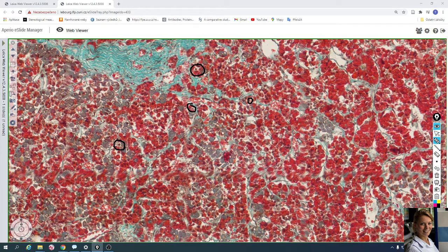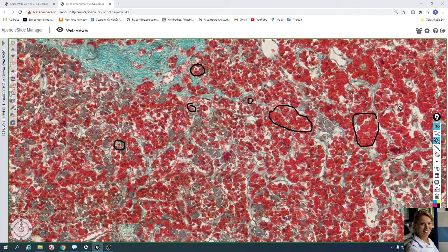Acidophilic cells in the modified trichrome appear reddish. Here is a group of acidophilic cells, and here are more acidophilic cells.